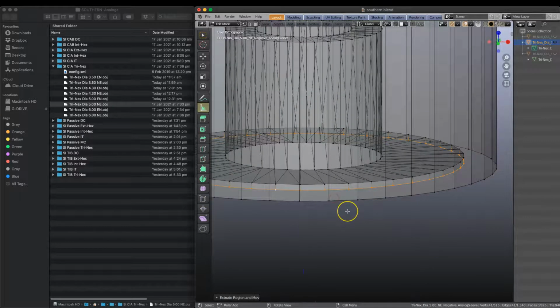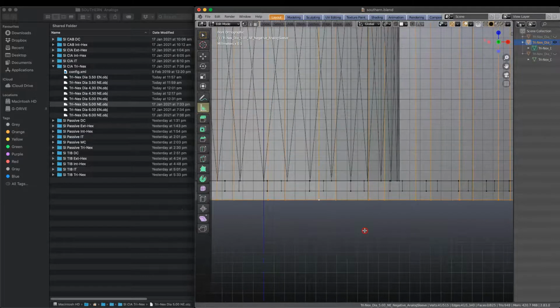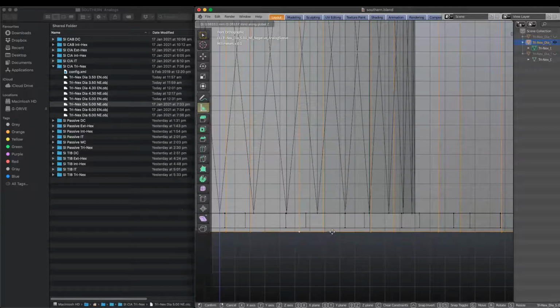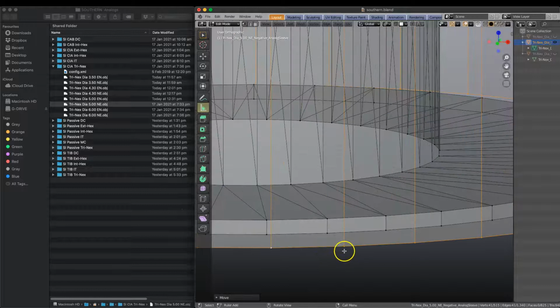Okay, so we're going to reselect the outer edge loop, Alt and left click. We're going to view it again from the front, and we're going to match these two together. So this time not E, because we don't want to extrude a new edge loop, we just want to move it. So we're going to use G and the Z direction, and just line it up with that line there. So from here we're going to double select. So the outer edge loop is selected, Shift, Alt and left click. So we've got both of these edge loops selected.